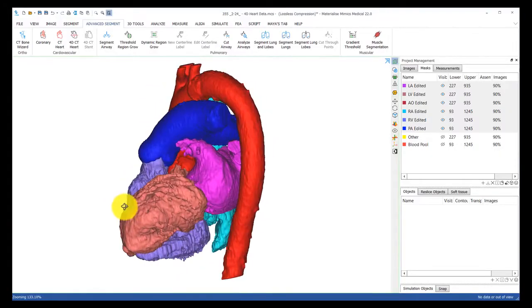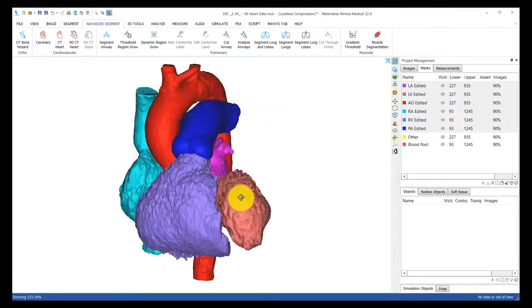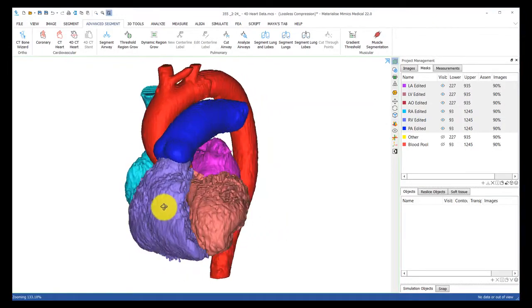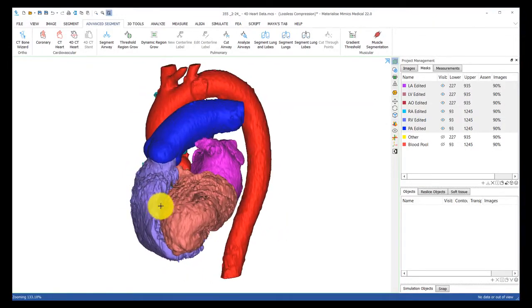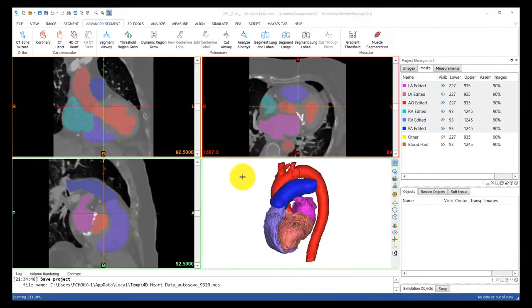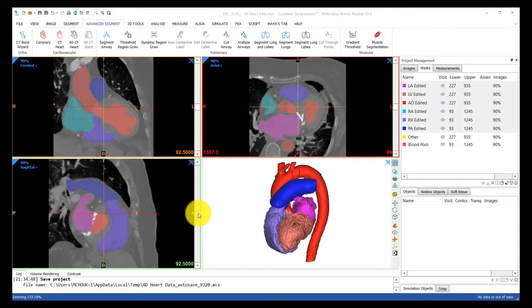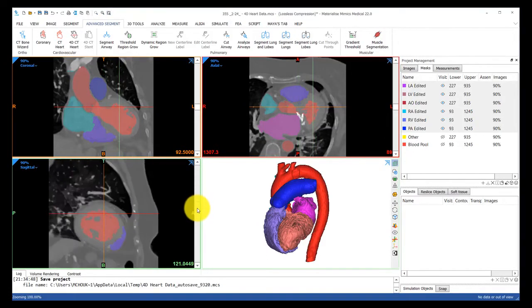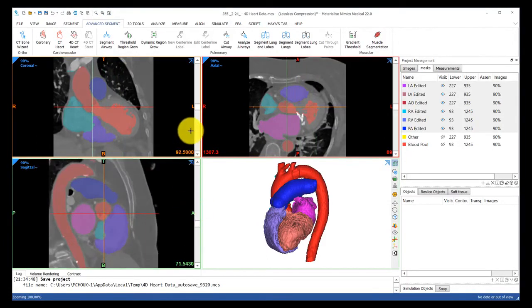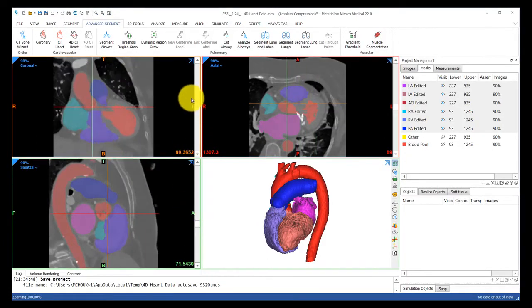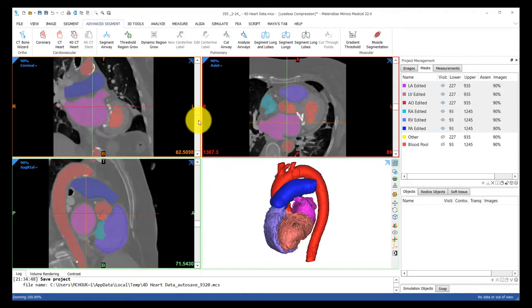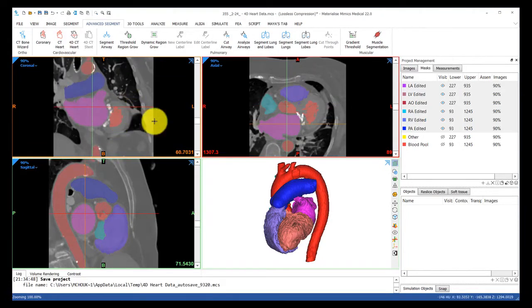Let's go ahead and work with this example here where we have the blood pool of all the chambers of the heart segmented and edited. You can see as I scroll through these images that this patient has calcium along their mitral annulus.